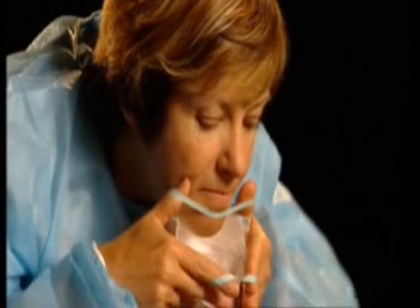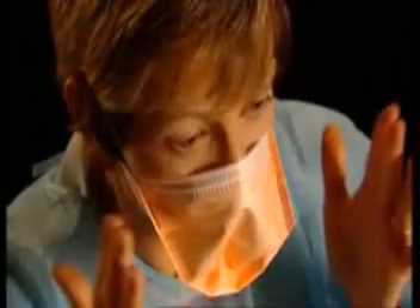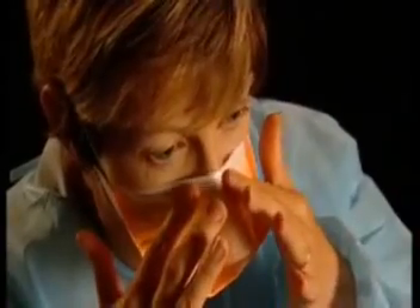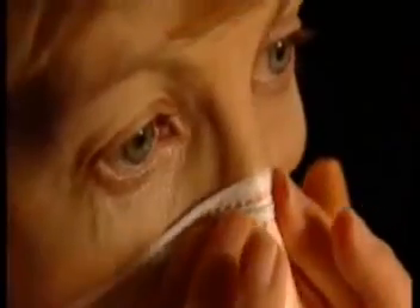Leaning slightly forward, push your chin out and bring the mask up to your face. Place the bottom section of the mask under your chin, then lift the straps over your head. Make sure the top strap is at the crown of your head and the bottom strap is just below your ears. Check that the mask is covering your face from under the chin to the bridge of your nose, ensuring the mask is not too high. Using your fingers, mold the mask around your nose and cheekbones, making sure the edges are well sealed and fitted against your face.